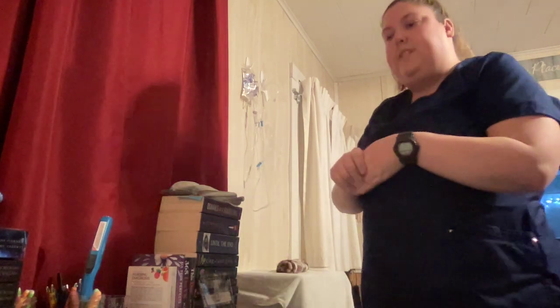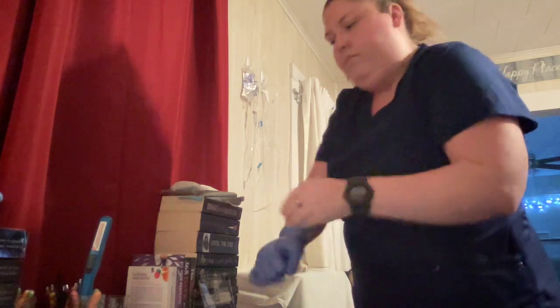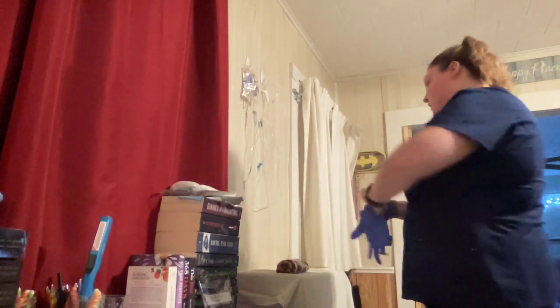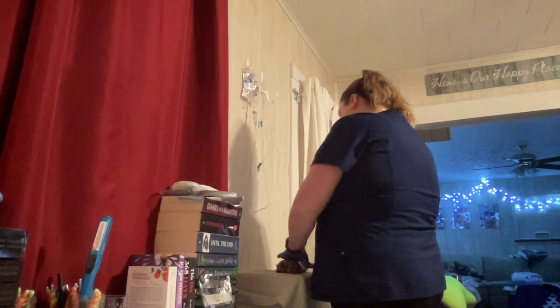I'm going to check my MAR one more time. Sodium chloride, normal saline, 500 milliliters. That's what I have here. Normal saline, sodium chloride, 500 milliliters. I am going to wash my hands. I am going to put some gloves on. I am going to check my IV site.